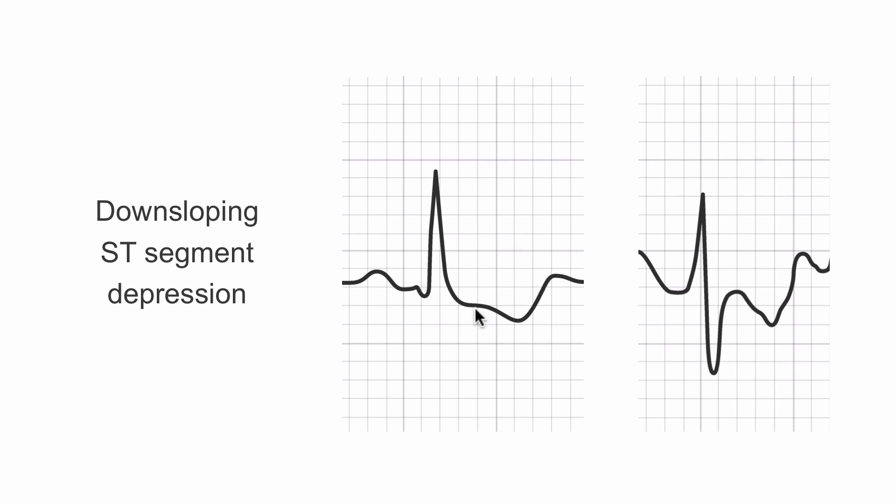On the other hand, sometimes our ST segment slopes down over time. Somewhere in here we go into our T wave. Here we have it down-sloping. This is what it's called when it goes down, down-sloping ST segment. In this case, we're going to get a very different measurement if we measure the ST segment here or here or here. We need some sort of guideline as to where we're going to measure.